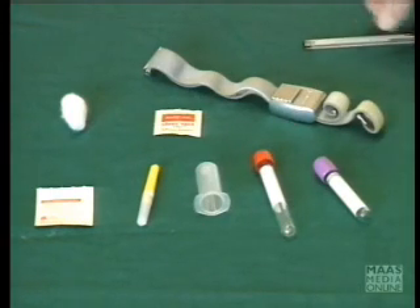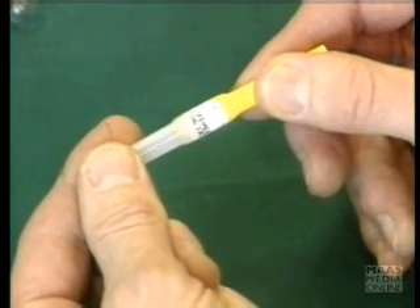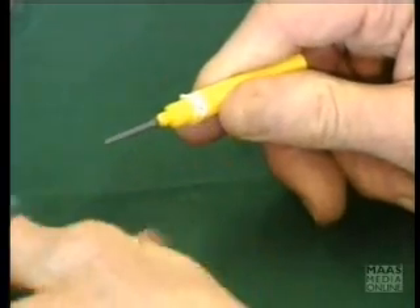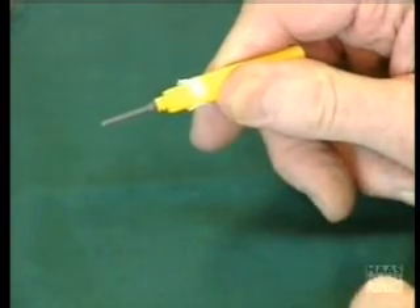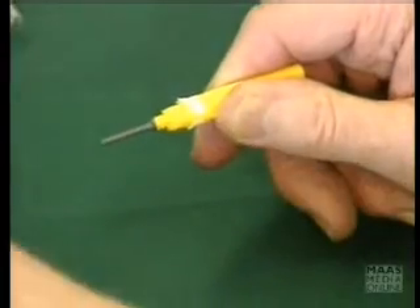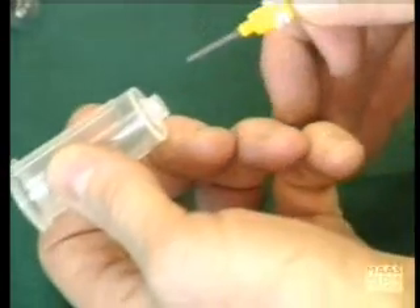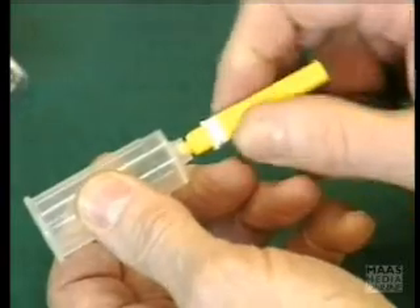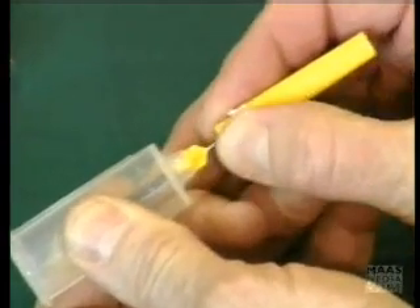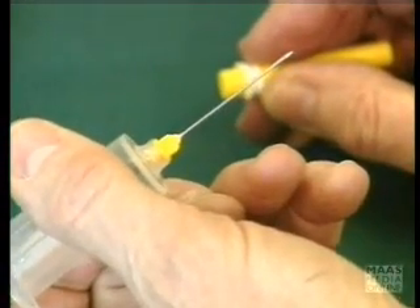First of all, let me show you the needle. The vacutainer needle has, in fact, got two needles molded together. What you do is you twist one cap off the plain, clear cap, and you'll see here a piece of rubber. And that part of the needle which has got the screw thread goes into the vacutainer holder in this manner. You just firmly put it on. The actual collecting part of the needle is this end here, and you can see the bevel and the needle hole.